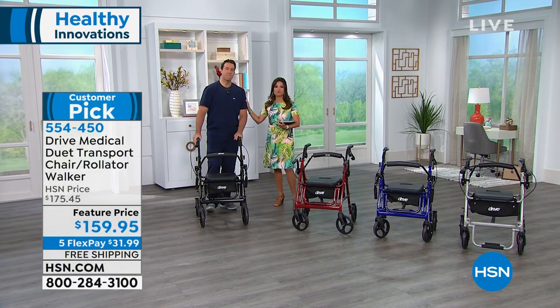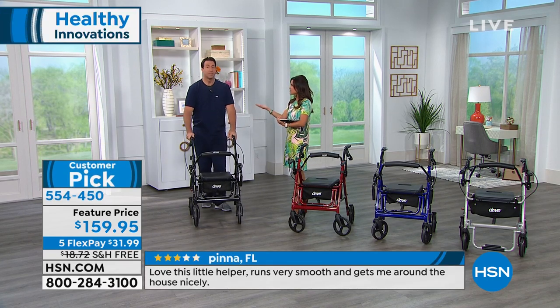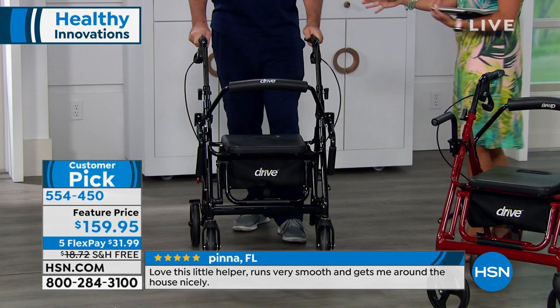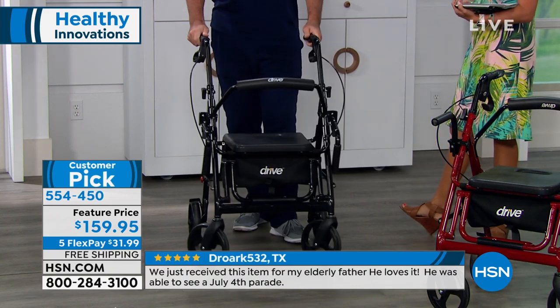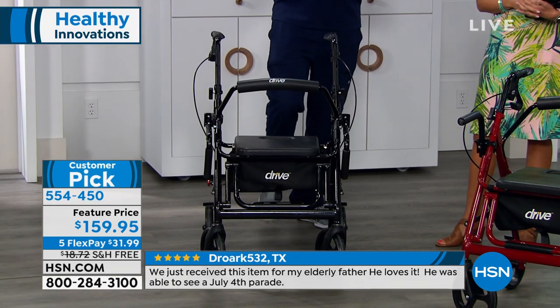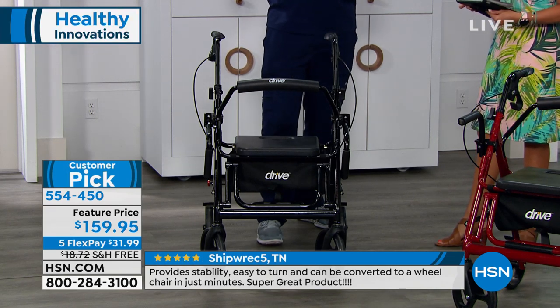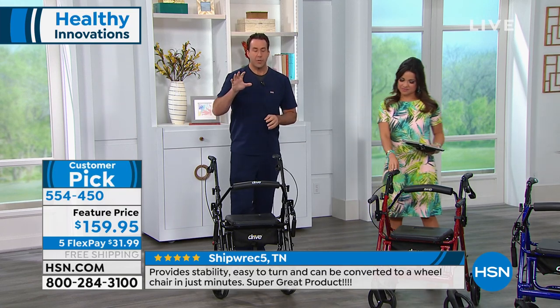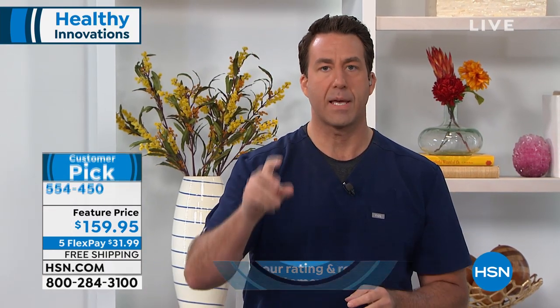I'm happy to have you here, Matthew — our resident RN, Matthew Peters. You've spent decades in the medical industry, and you know the need for something reliable and high quality that gives us our freedom back. Drive Medical, I say this over and over again — for those who've seen this on HSN, it's so popular. It's a customer pick because it really does change your life. You cannot compare this to your traditional rolling walker or transport chair because it's a two-in-one.